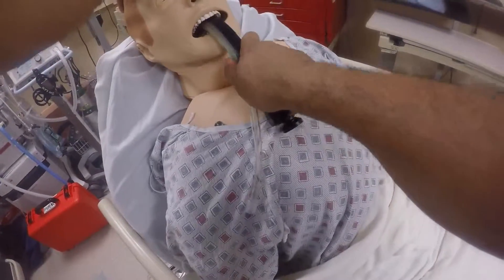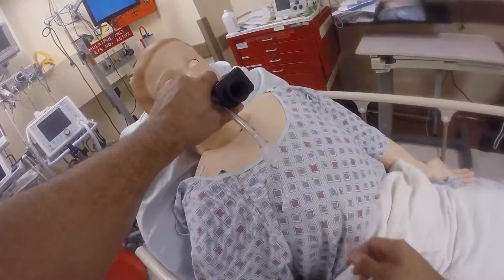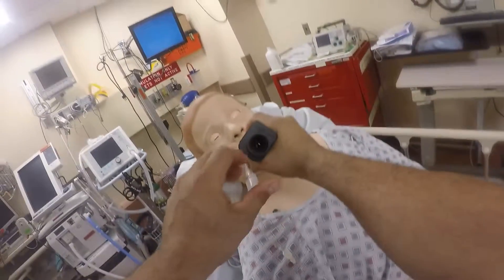Open the mouth and slide it down. The only bad thing about this device is you've got to make sure the light source is on and working. Hit down the channel — see the cords. We have to switch hands up. The tube is going in now.